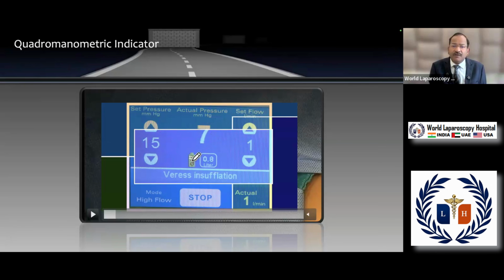This is the amount of gas in the cylinder. This will decrease and it will become empty if your cylinder is getting empty, just like your mobile battery indicator, which shows empty if your mobile battery is discharged. So this insufflator, you can see, is flowing the gas. Now it is increasing, 7, now it is 8. And this is 9, and once this 1 liter has been reached, after that you can increase this flow rate to 3.